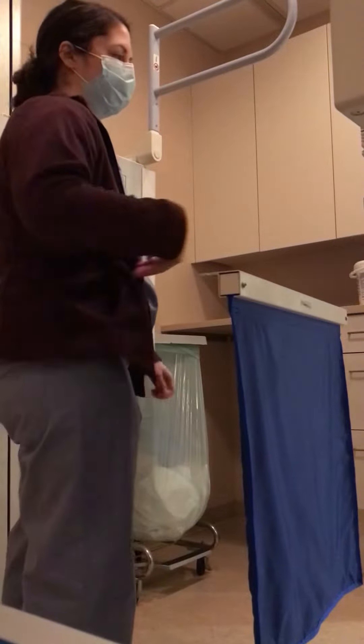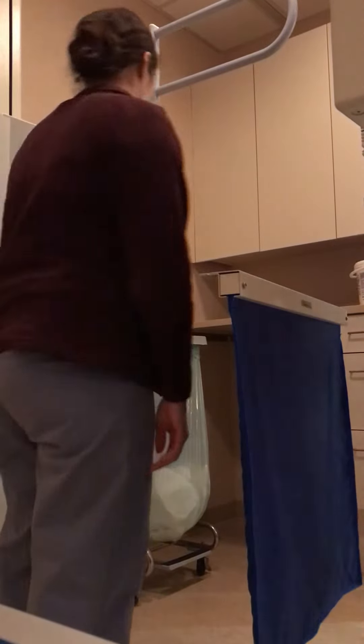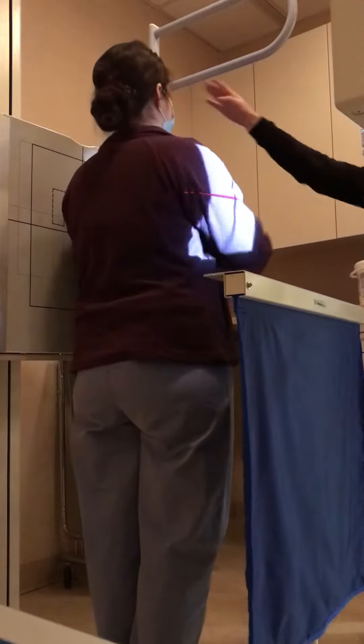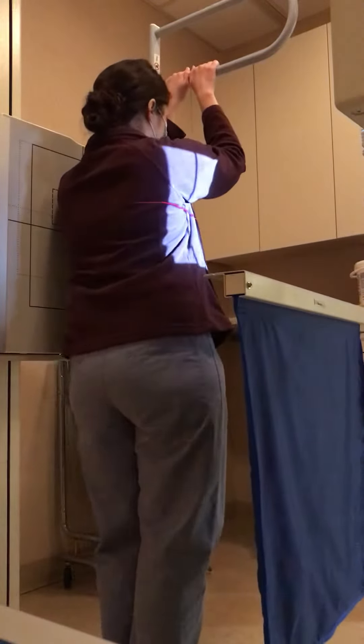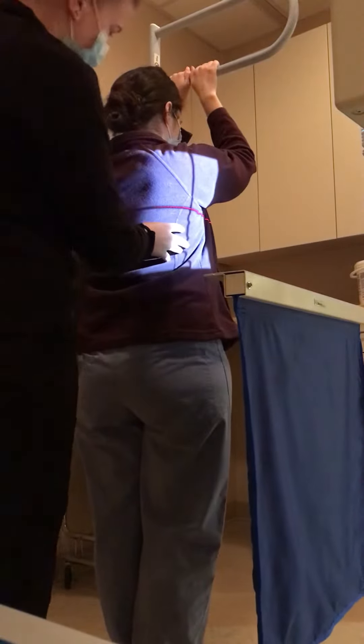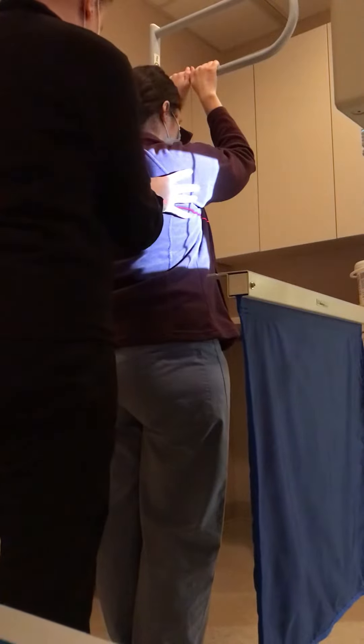Here is my lateral T-spine. I'm going to have you put your left side against the board. Both arms, I'm going to have you just rest up on this bar. I'm going to have you take a little step forward. I'm just going to straighten you out a little bit.